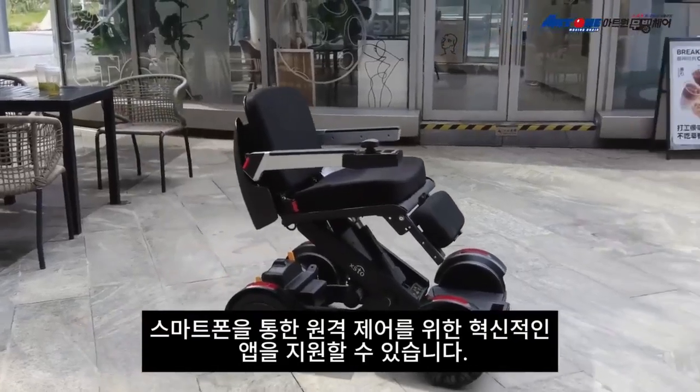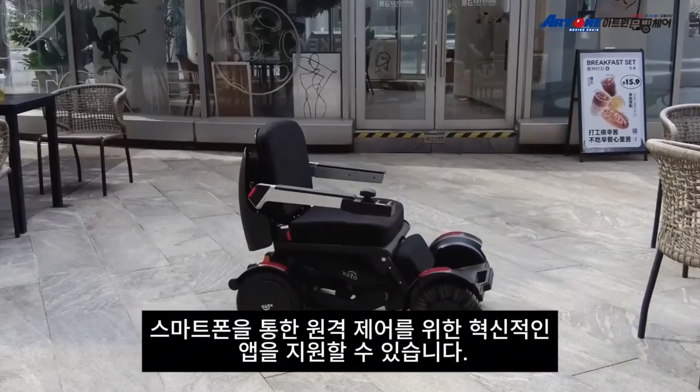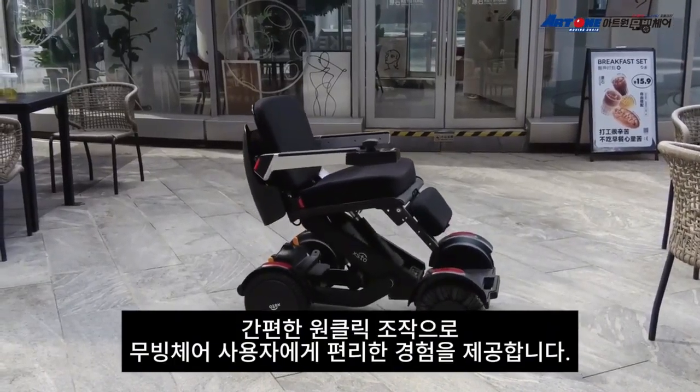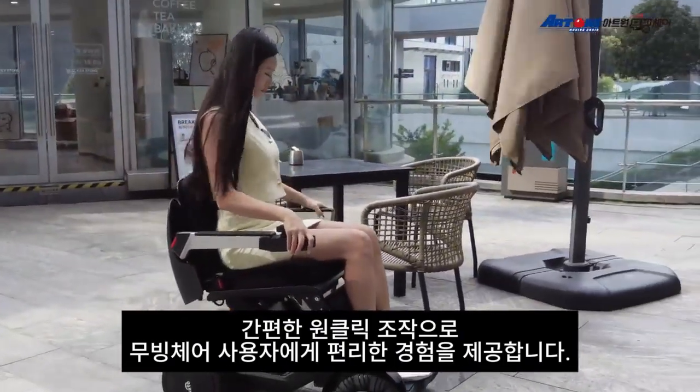It supports an innovative app for remote control via smartphone — one-key folding and unfolding, one-stop operation, easy to use. It gives wheelchair users a very convenient experience.